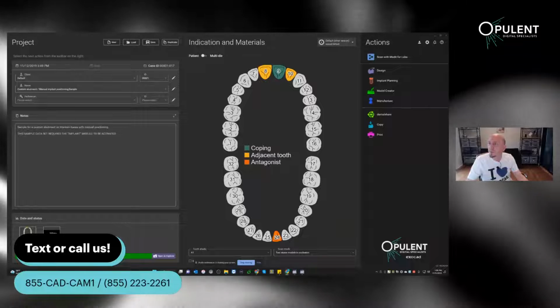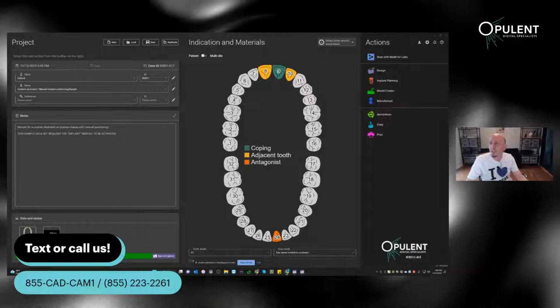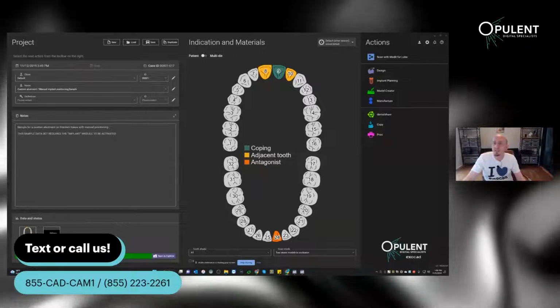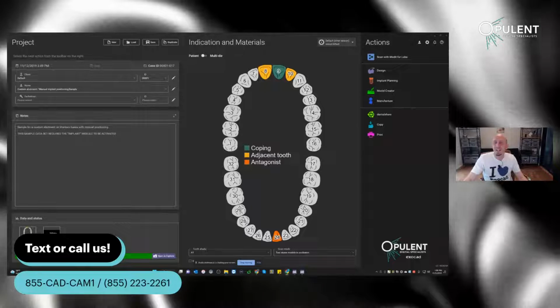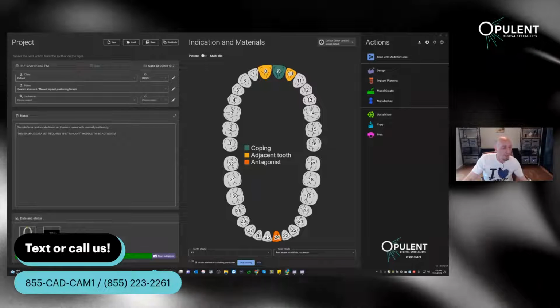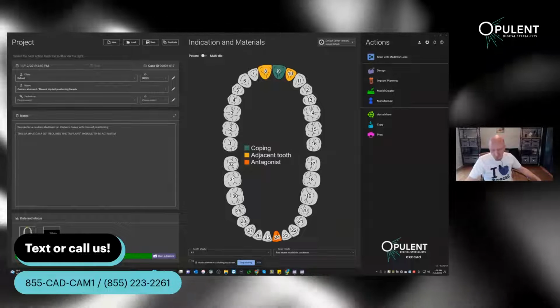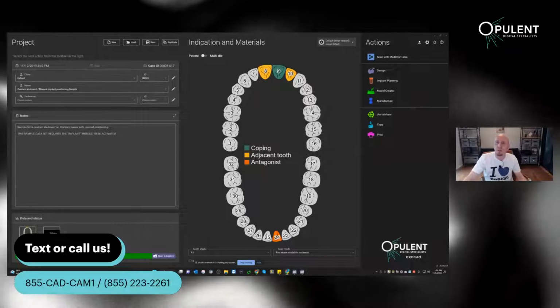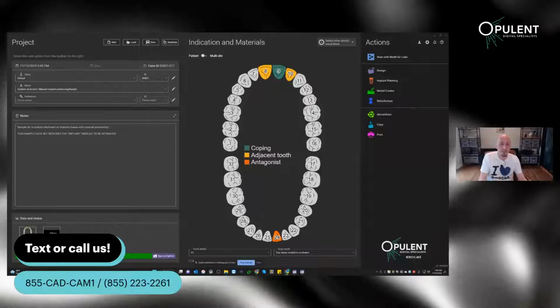There is a question. Hi, Matt. Can you make a stackable guide in Exoplan? Oh, well, you can, but it's a little unofficial, I guess. I also have to play with that quite a bit. I have a couple of friends who have already done those, and I want to catch up with some of them. One of them is actually making trainings, and I already reached out. I just haven't heard back from him. I want to partake in his training and see what I can learn.